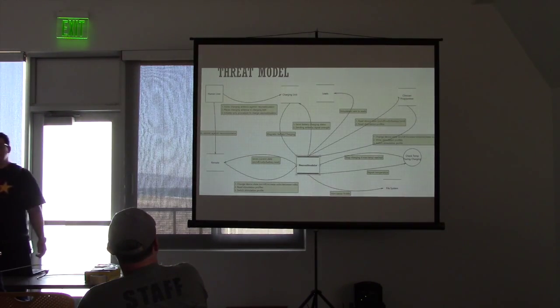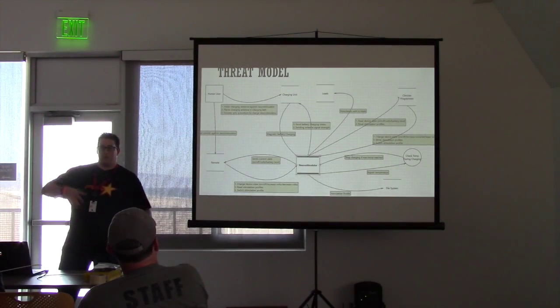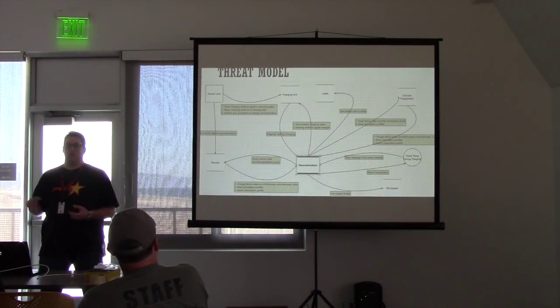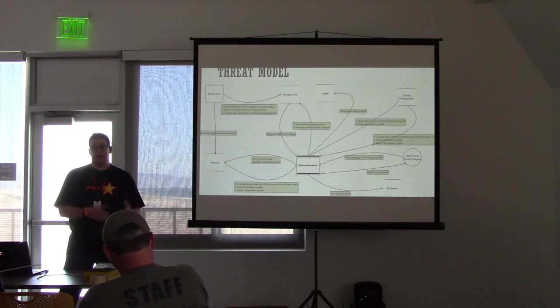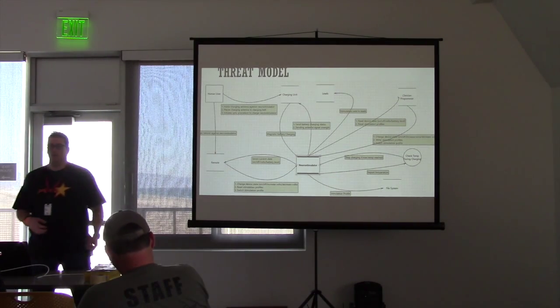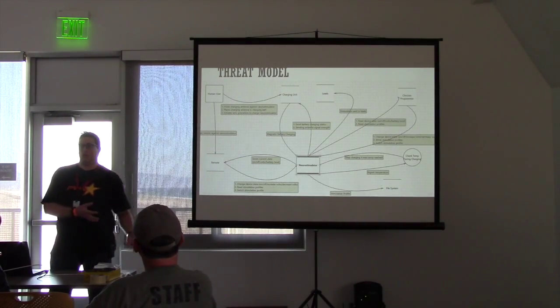As far as the clinician themselves go to the programmer, when you program it, it turns it on and tests it, so you would know, because on the remote, it shows you what the modes are and the strength. So they don't just program it. I suppose they could, but that breaks the protocol. They're doing it with you and saying, all right, is it hitting the right muscles or the right nerves in your leg? My wife would say, all right, I'm feeling it in my right foot instead of my left foot.